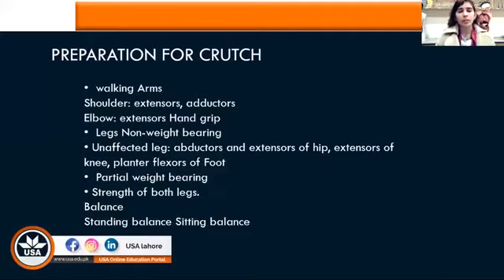After that, we will see what the elbow extensors should be helpful with. While transferring weight to the crutch, the elbow goes into extension. So if the elbow extensors are strengthened and worked on beforehand, then there would be less fatigue to the patient while they are walking with the help of crutches.